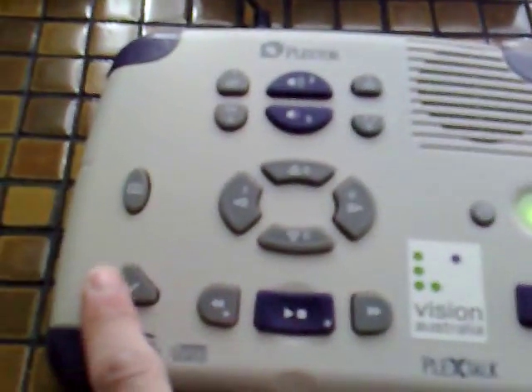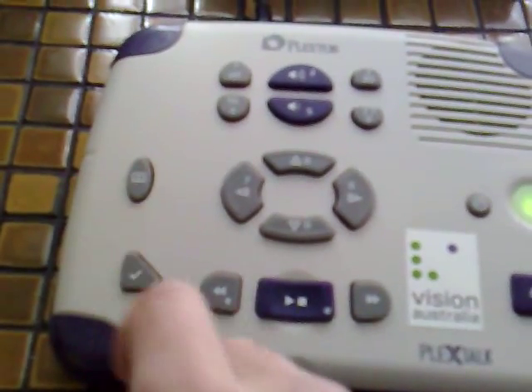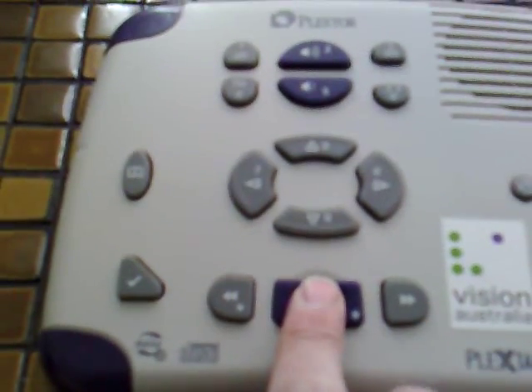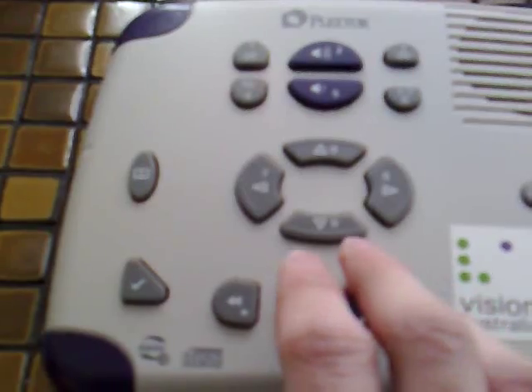Let's set a bookmark here. So we'll push the Bookmark button. These buttons also act as numbers, so we'll press one, and then press the Play button which acts as Enter. Bookmark one is now set, so I can easily jump back to that position if I want to.